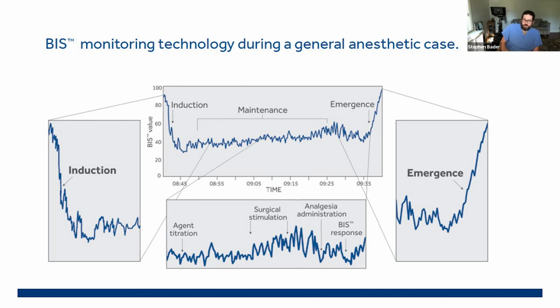By using that, we also probably shorten their PACU stay and reduce some of the other side effects of giving more agent than is necessary. So prolonged emergence in the operating room, generally speaking, leads to prolonged PACU stays and postoperative delirium risk.